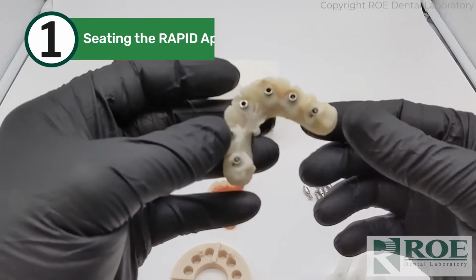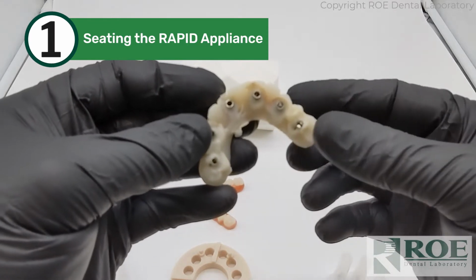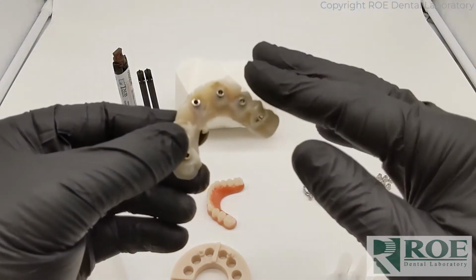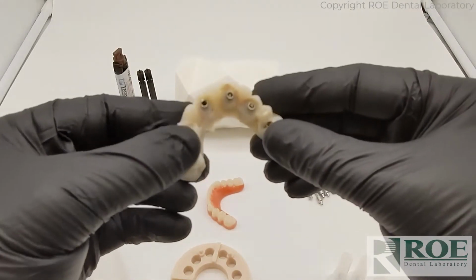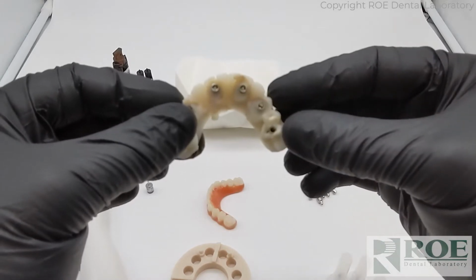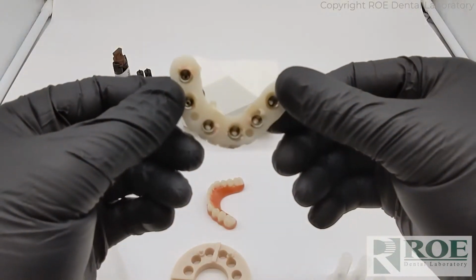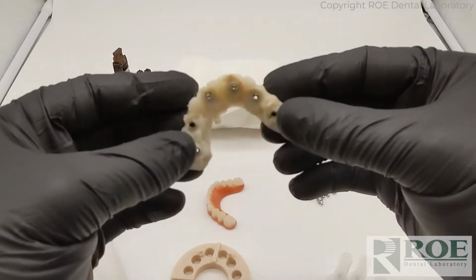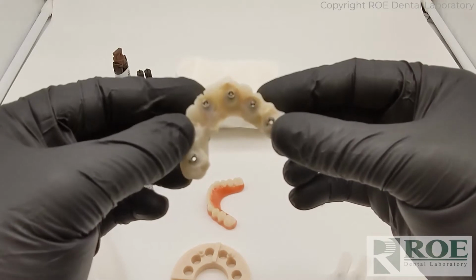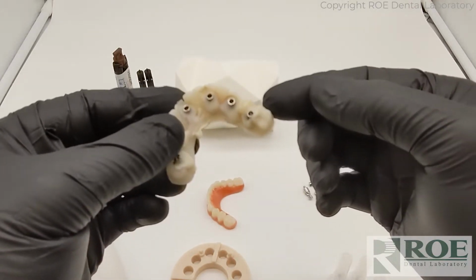The roto conversion process starts with a RAPID appliance. Just like all of our CHROME cases, you'll pick up the RAPID appliance in the mouth, and then in surgery, you'll stop. You're not going to pick up the take-home prosthetic, only the RAPID. So once the RAPID is picked up, then the patient can be sutured, and the CHROME fixation base and pins can all come out, and you'll go through your process, post pickup, and then the patient will just kind of hang out until the roto prosthetic is converted.